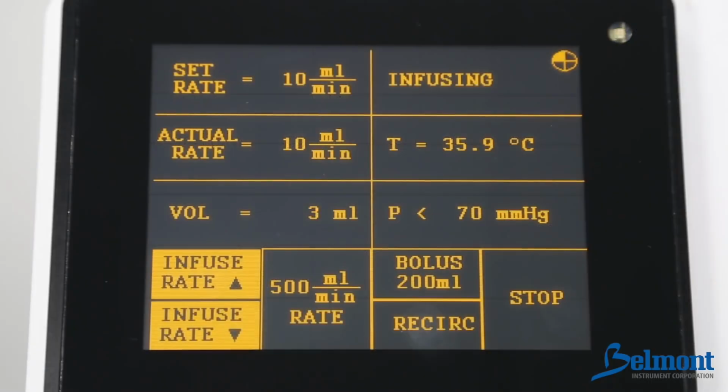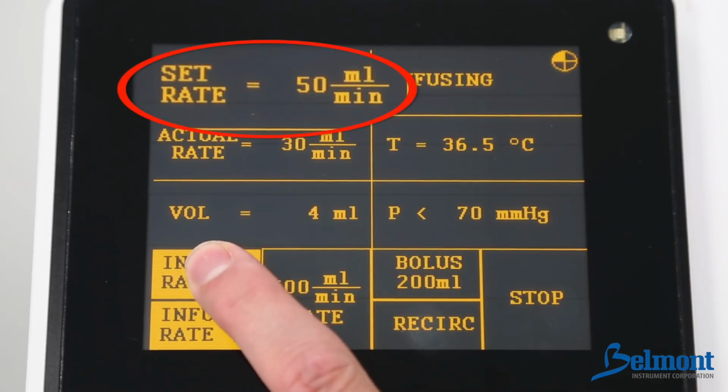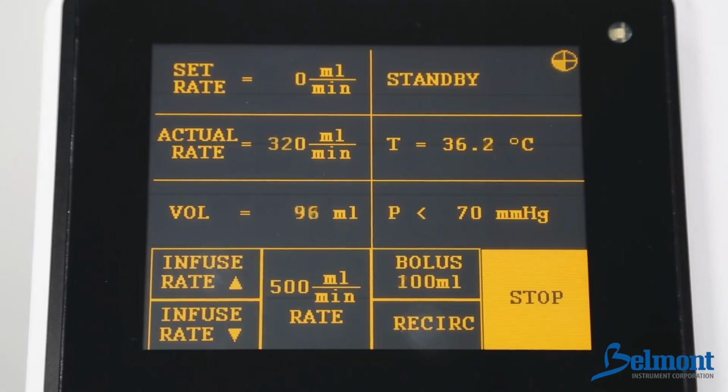Press the up and down arrows to increase or decrease infusion rate. Press and hold to change the rate quickly. Fluid will be precisely warmed at all infusion rates. You can press the stop button at any time.